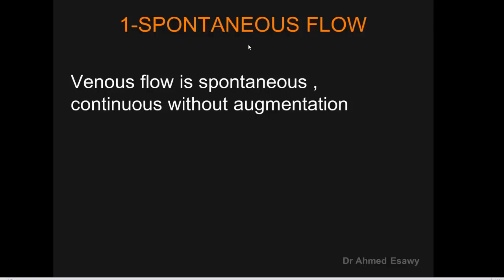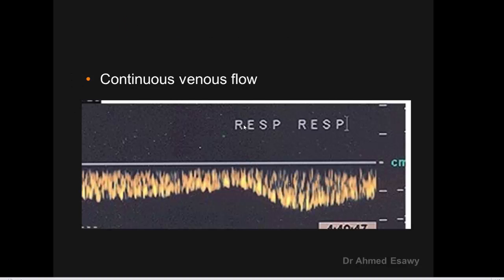Spontaneous flow means venous flow is spontaneous — continuous without augmentation. Continuous flow is not interrupted and occurs without augmentation. This is the normal appearance of venous flow.